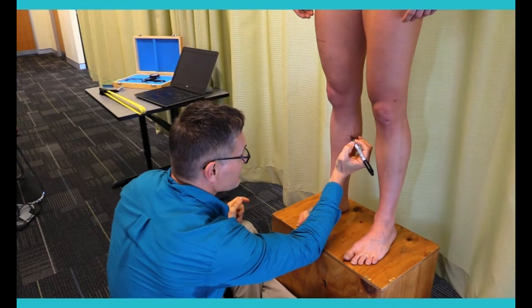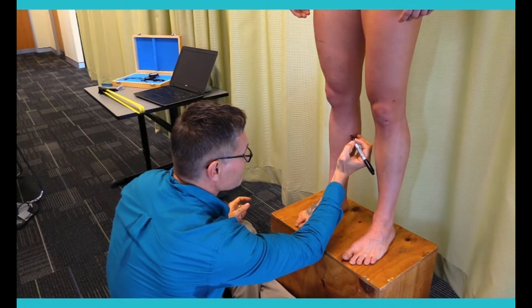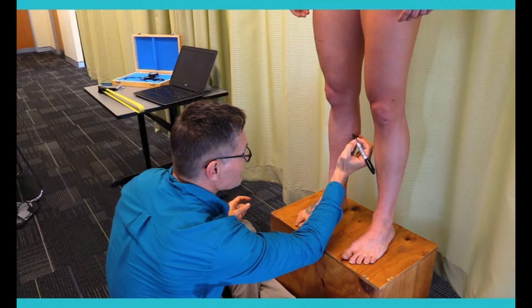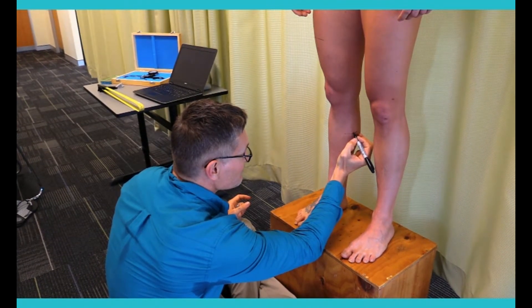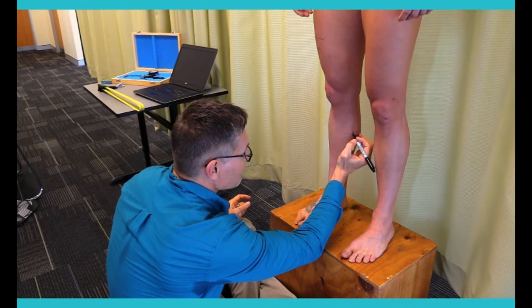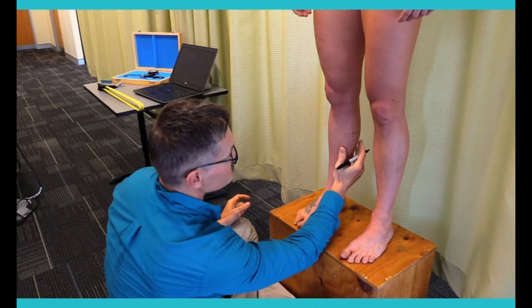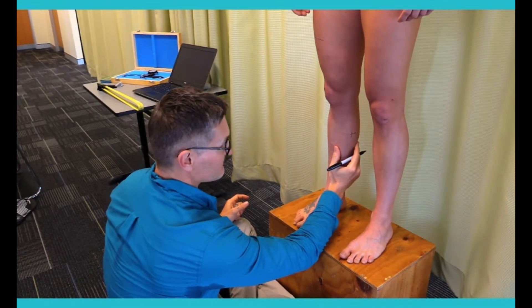Taking the tape away, and now I'm just anchoring my head directly in front of her leg, moving the pen tip along the line I've just created until I can no longer see the tip of the pen, bring it back until I can see it, and I mark that vertically to identify where the calf skin folds are.